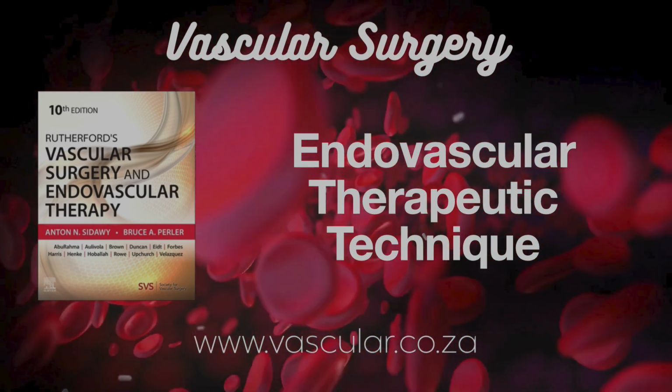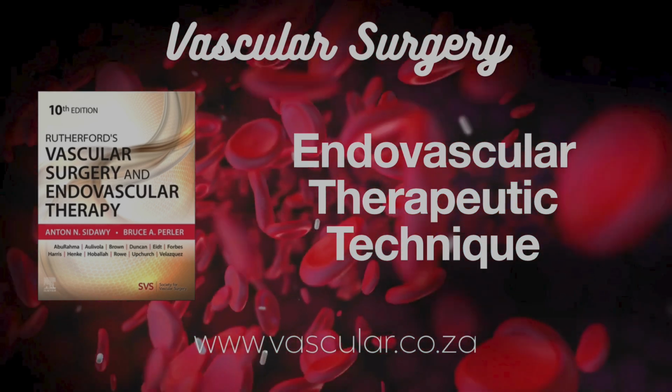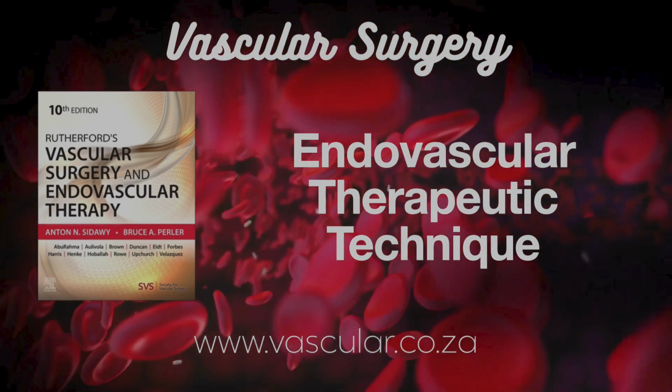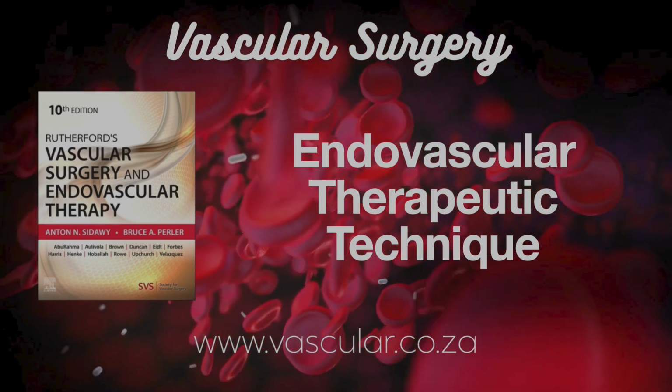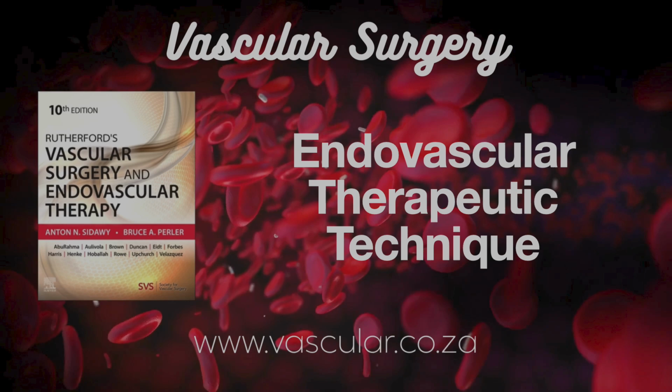The no-stent zones. Exactly. And even for in-stent restenosis, where scar tissue builds up inside an old stent. They're generally not for long, sprawling blockages. The key is those small cuts help disrupt the plaque, allowing for better dilation with less recoil.